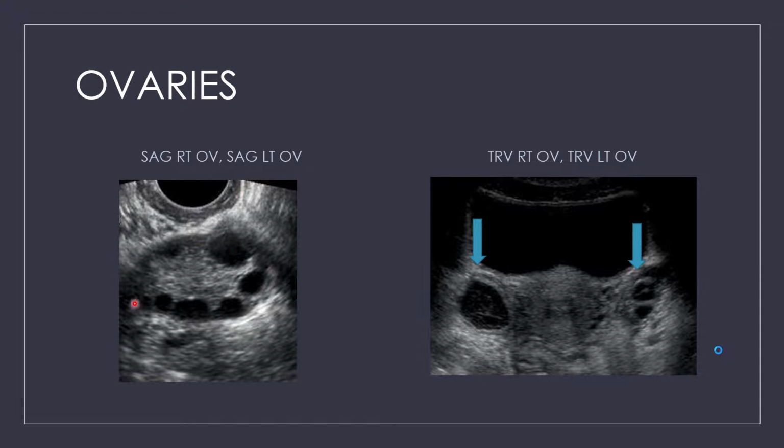Again, this is an endovaginal scan, and we can see the ovary here. There's lots of little anechoic circles. Those are just normal functioning follicles, okay? Over here, this is a transabdominal scan, and it's transverse. We can see the uterus right here.